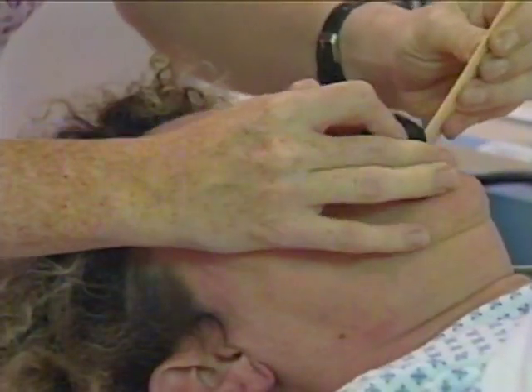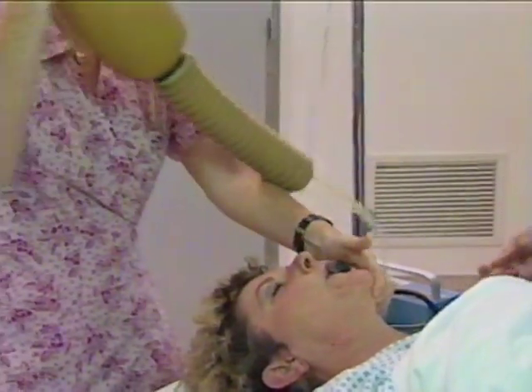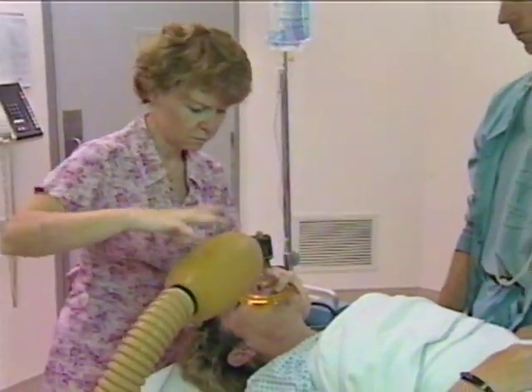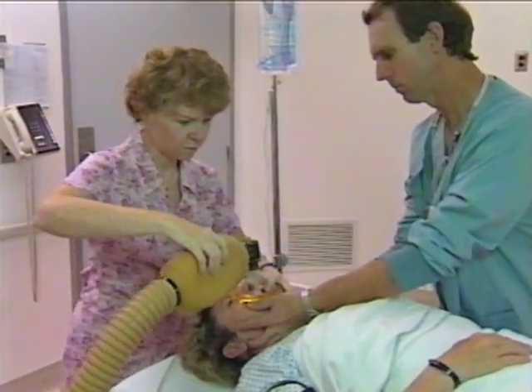The ability to manage airway obstruction and to ventilate the patient with a bag valve mask device are essential skills in patient management. Early intervention can and does prevent problems and improve outcomes. Mastery requires experience. Practice at every opportunity.